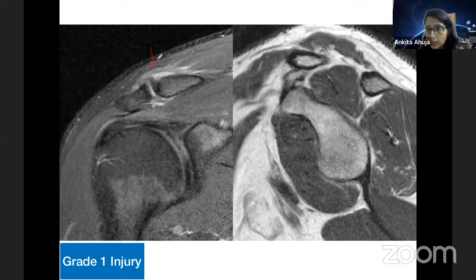To be true, as a radiologist, I cannot tell you on MRI alone whether this is acute or chronic if it's only grade 1. It's your clinical history. If there is an acute injury or a chronic injury, that helps me figure it out and put it in some bucket. So clinical history is very important if you want to differentiate acute versus chronic in very early stages.